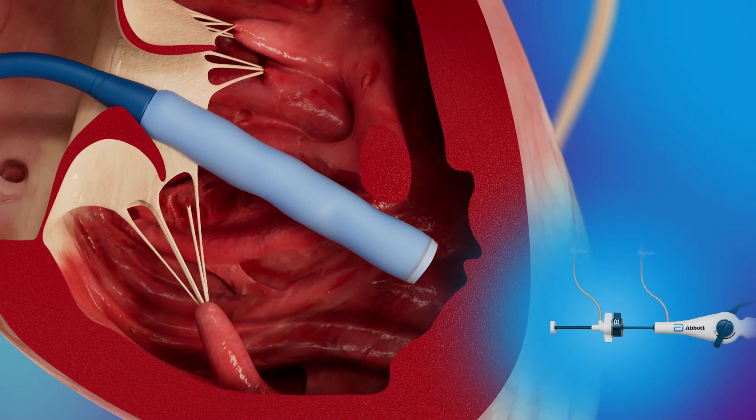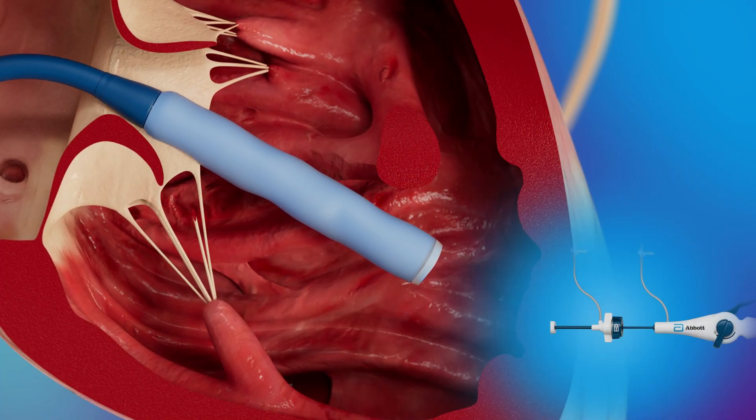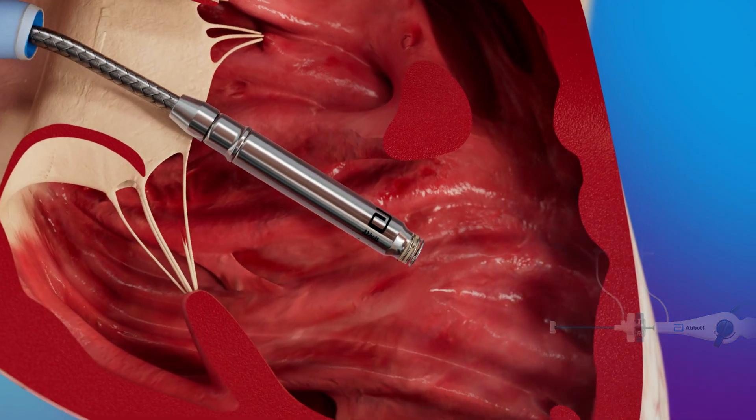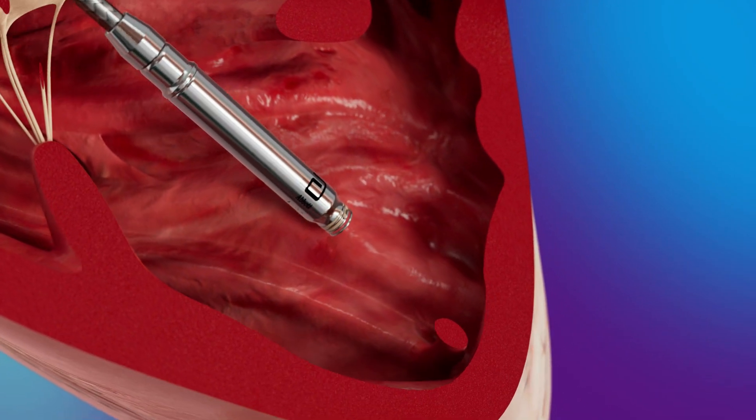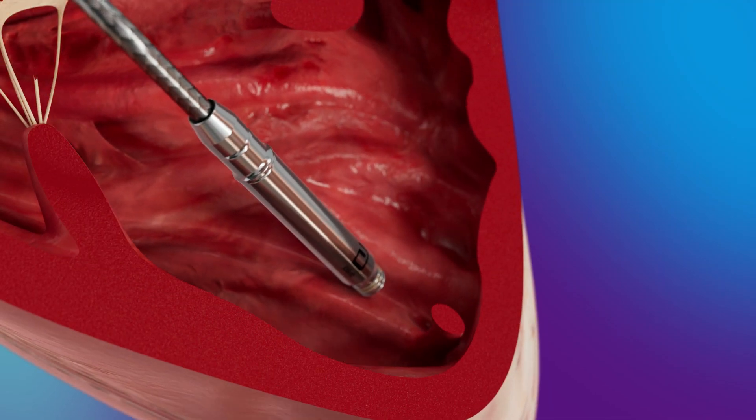The typical target location is the distal septum. Once at the target location, the protective sleeve is unlocked and retracted, exposing the Avere VR Leadless Pacemaker. The device is advanced until it contacts the myocardium to allow for mapping of the location.